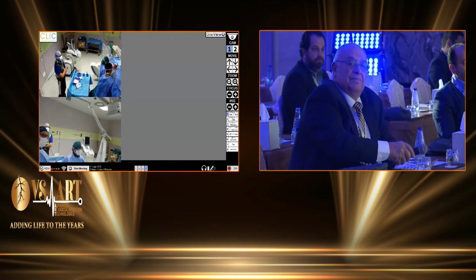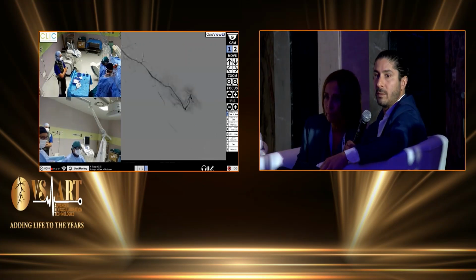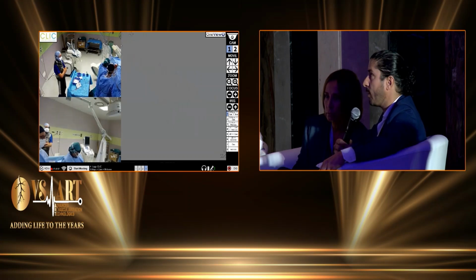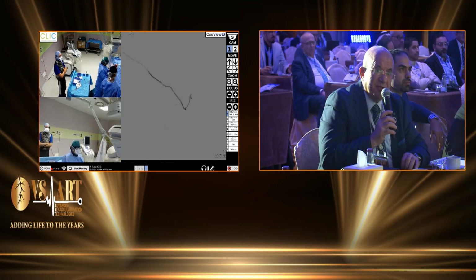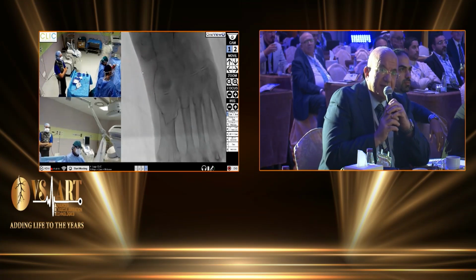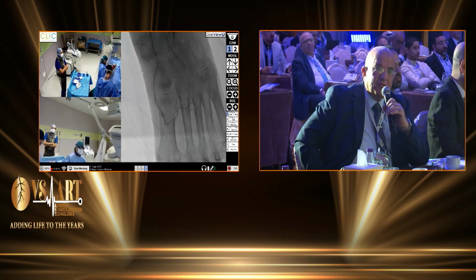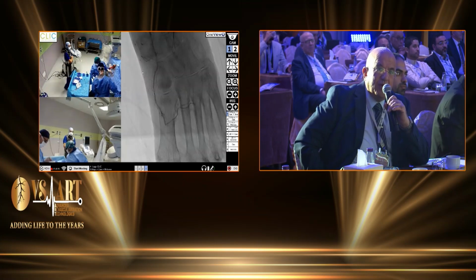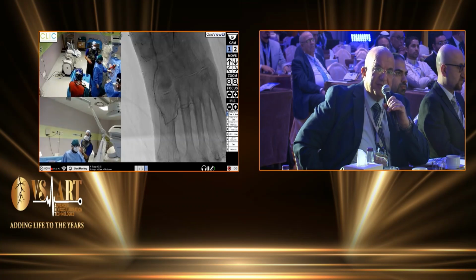Thank you. Adesso gli riporto l'anestesia dentro. Yep, there is another question from the audience. Thank you, Mariano, for the nice presentation and the cases you presented in your talk. Still, distal embolization during lithotripsy and atherectomy devices, especially in tibial vessels, is a problem. Do you use any protection during your procedure, or it doesn't matter for you?